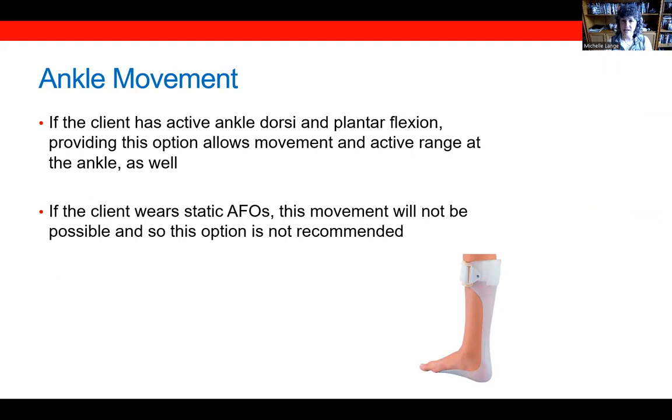So if the client has active plantar flexion that you're observing, then this would be something that would be appropriate to add into a dynamic footrest. It provides some movement and active range of motion here. If the client is wearing a static AFO, for example, then that movement's not possible. And in that case, we don't recommend adding on that option.